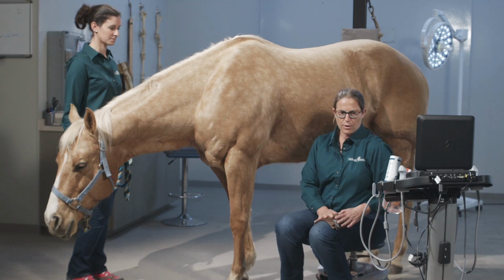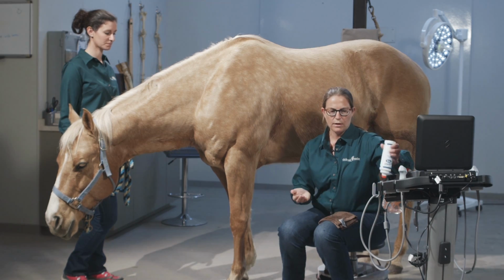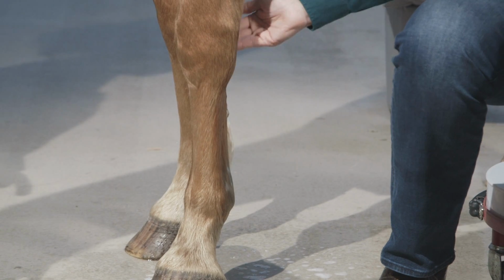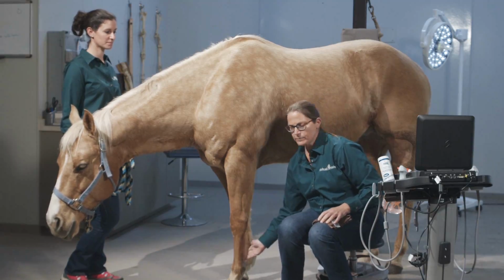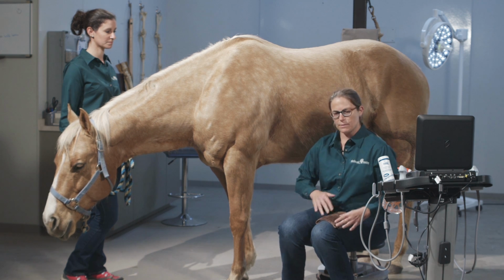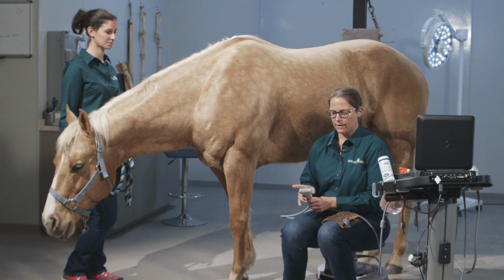The next step in the process is to go ahead and take ultrasound gel and put it on the area of interest. Put the ultrasound gel on going against the grain of the hair. And that will work the ultrasound gel up into and in between the hair. And that will oftentimes help, again, by filling in all the little air bubbles and air gaps that are in that area. And then the last thing I'll use, once I'm ultrasounding actively, is alcohol on the leg to try to fill in any of the little gaps that are left.